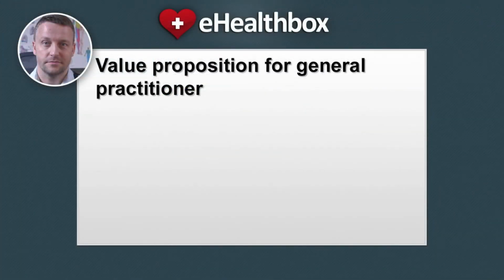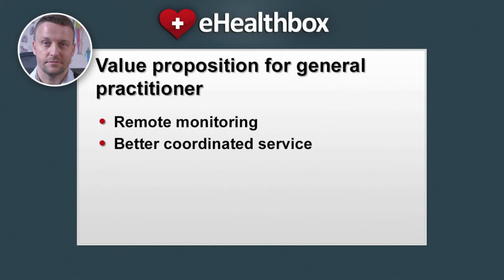Value proposition for the GP. The eHealth box enables remote monitoring of the GP's patients so that the GP will know if a citizen needs extra care. The eHealth box coordinates services better, so that, for example, bookings can be coordinated with the patient's other health activities at the hospital or with the home nurse.